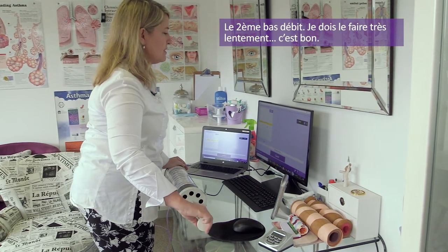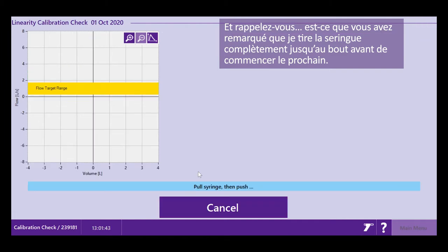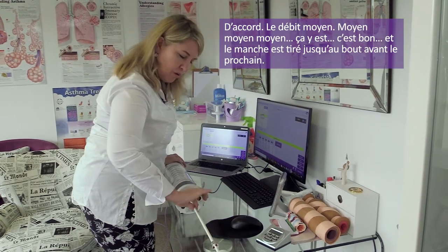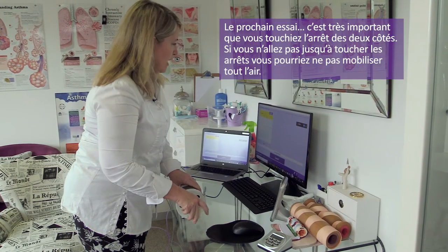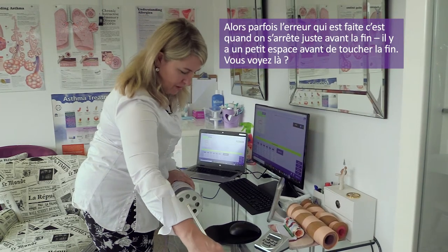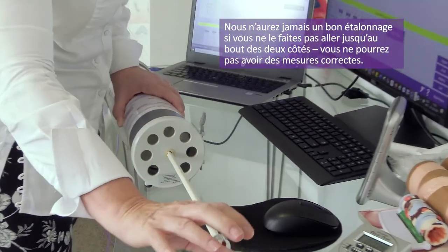This is my second low flow — I need to keep it very, very slow. Remember to pull the syringe handle out totally before doing the next one. Then medium flow. Very importantly, you need to make sure that you touch — if you don't touch, you might be missing a little bit of air. Some mistakes are made when people leave a small gap and never push it all the way in or pull it all the way out.